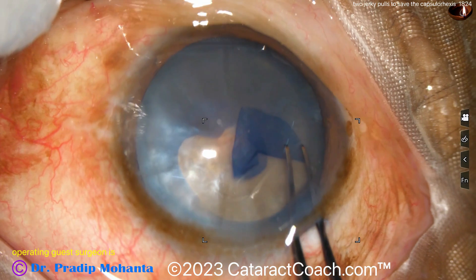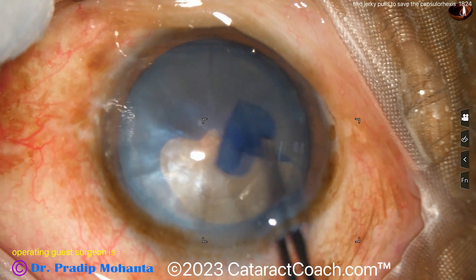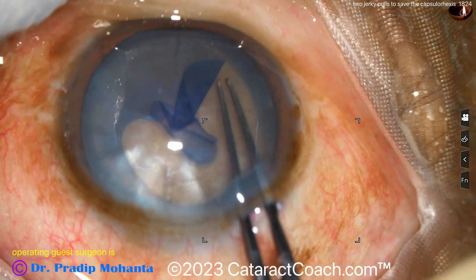So what he's going to do is grab the capsule and have two jerky pulls — one, two. Once it's grabbed, one pull and another pull, and that gets it back on track. So again, a good alternative to the little rescue technique.